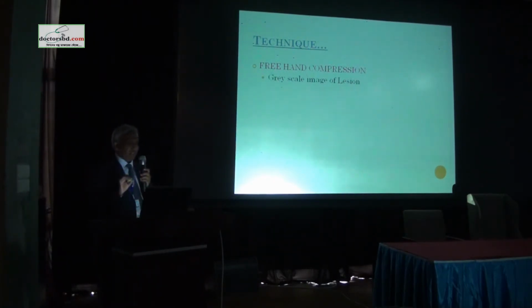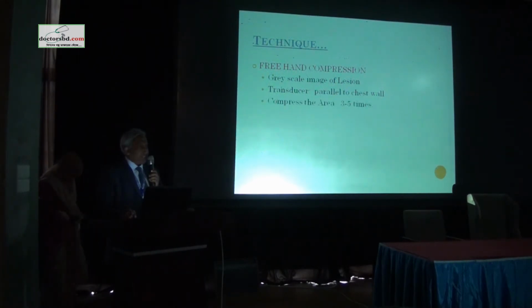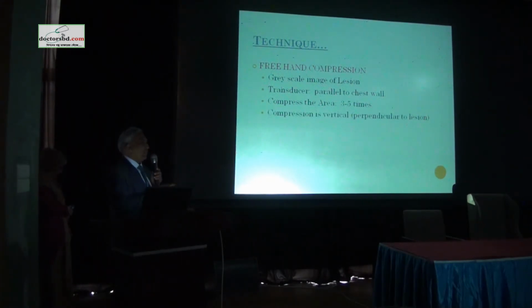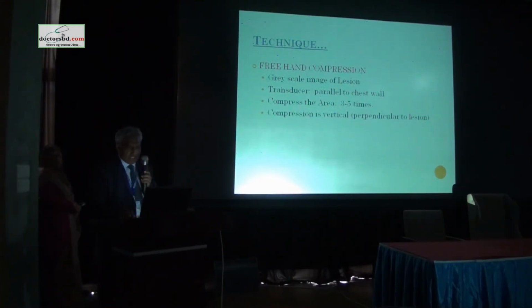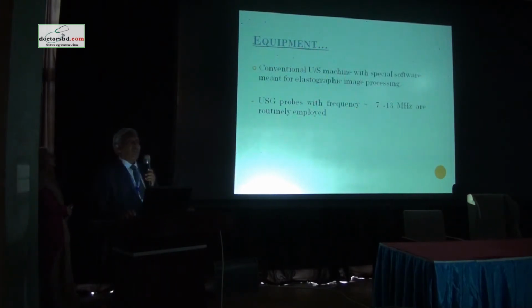Just to briefly tell you this technique. It's a kind of free hand technique where you select the lesion and then you put the high resolution probe parallel to the chest wall, exactly perpendicular to the lesion. Try to press gently, with almost equivalent gentle pressure, which you can assess by looking at your sinusoidal wave pattern, and then you switch on after 4 to 5 seconds. You switch on the elastogram, and you will find the image automatically displayed on your monitor.